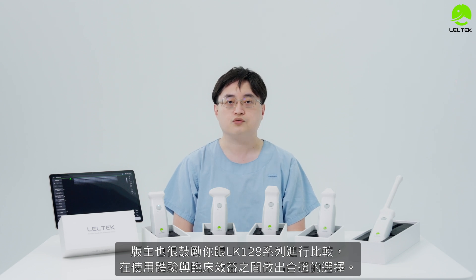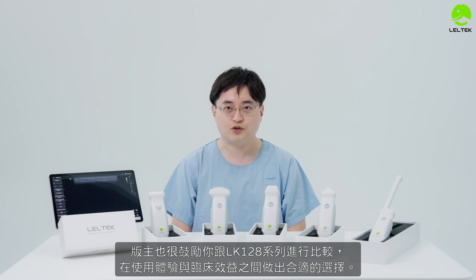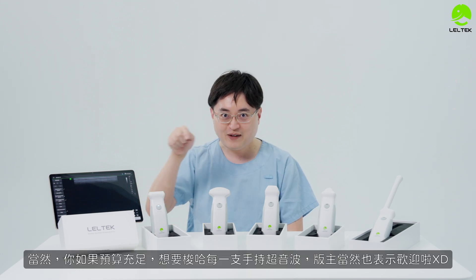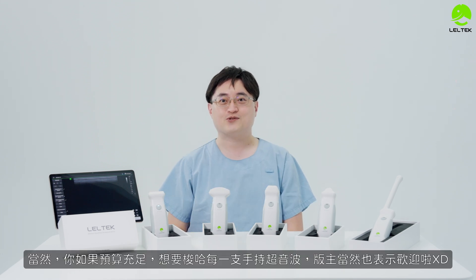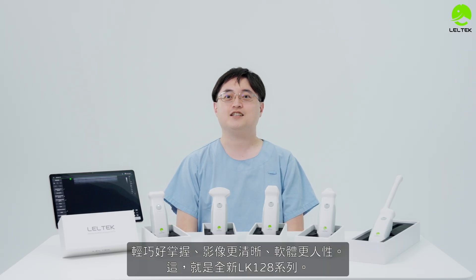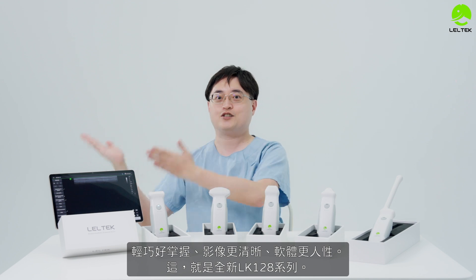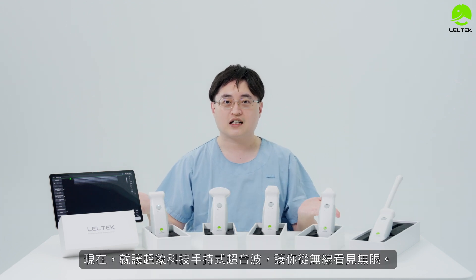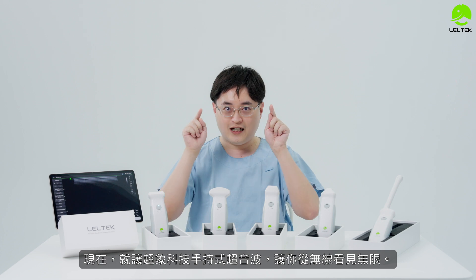You can make the best choice with the LK-128 series experience. If you want to get the best out of your practice, the LK-128 series will not disappoint. This is the new LK-128 series — 讓你從無限看見無限 (Let you see the infinite from the infinite).